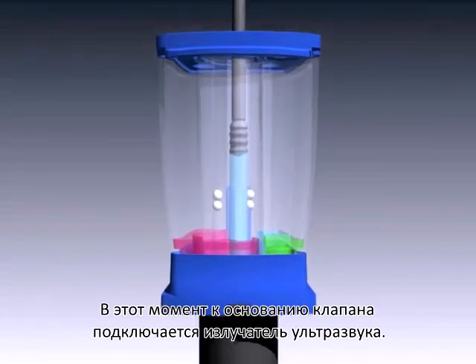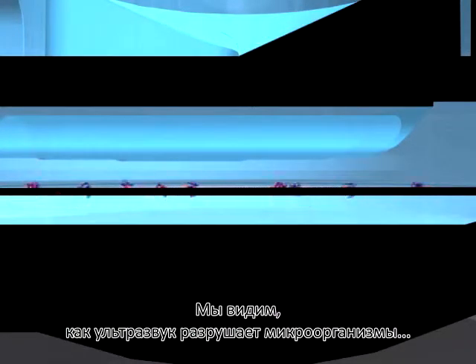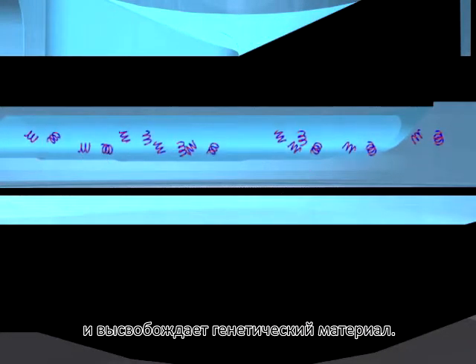At this point, a sonic horn is engaged against the base of the valve body. Here we see the sonication, which breaks apart the organisms and releases the genetic material.